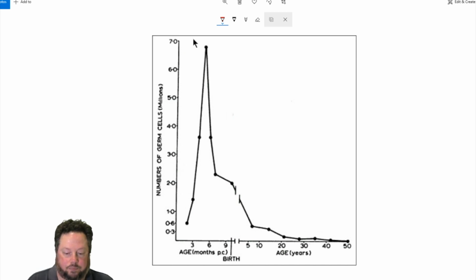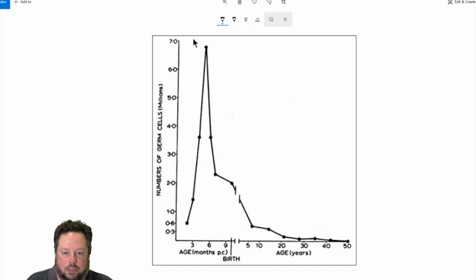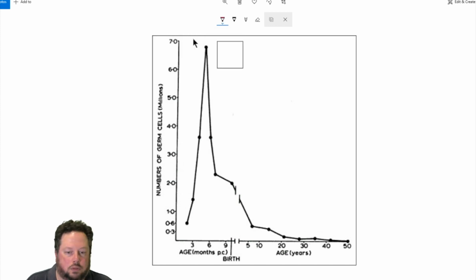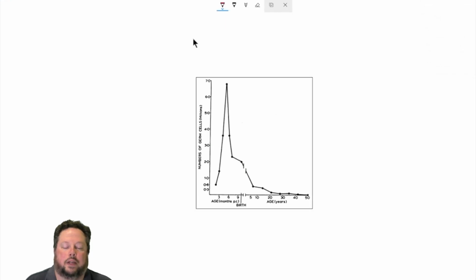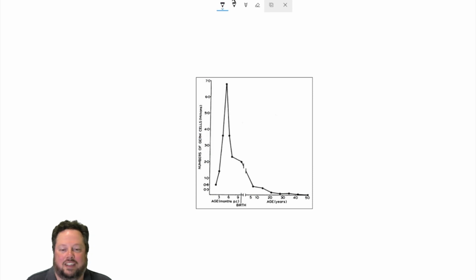There's a magnifying glass above the... Well done, awesome, thank you very much. Stimulate my follicle, how appropriate. It's not letting me draw on here now. Why aren't you letting me draw? Hold control. Okay. Oh, that's so bizarre. It's really not allowing me to do both at the same time. Oh, come on.